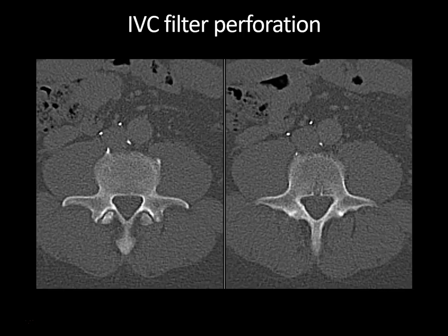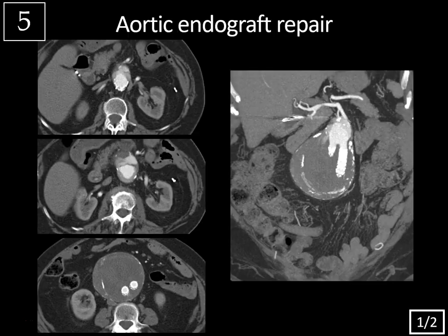However, it's important to mention if you see IVC filter perforation extending into an organ because that may cause some difficulty in IVC filter removal. So in this case, this limb was partially embedded in the cortex of the vertebral body, and it was a little difficult to remove, but it was still successfully removed from the patient.